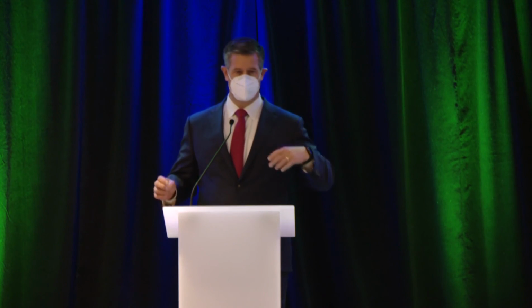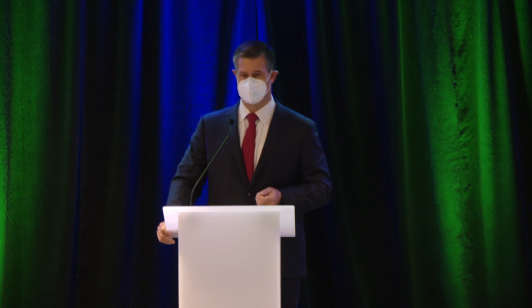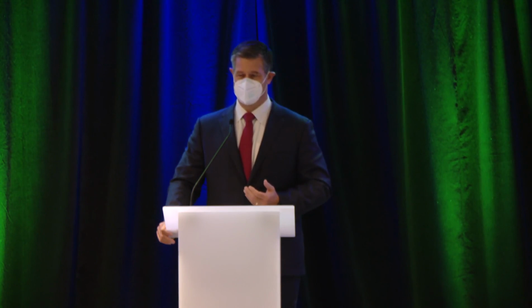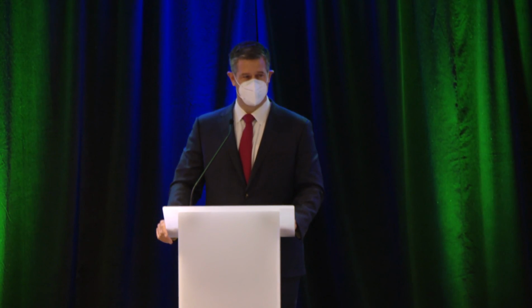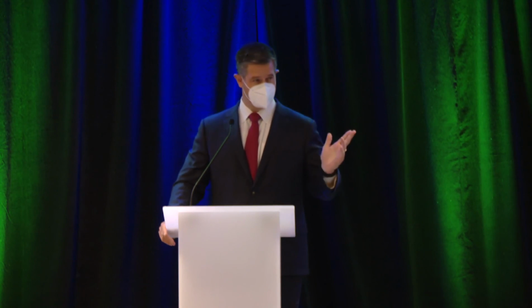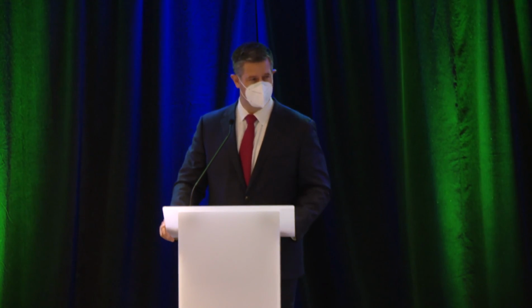But if you see some with a bunch of gagging and so forth, or double swallows, which are very, very common, that can be a technical issue. Sometimes it's more a patient issue, but in any case, you can throw those out. You can delete them and be left with 10 that you can feel more confident with. So I think that's an outstanding point. Any other comments from the other folks?